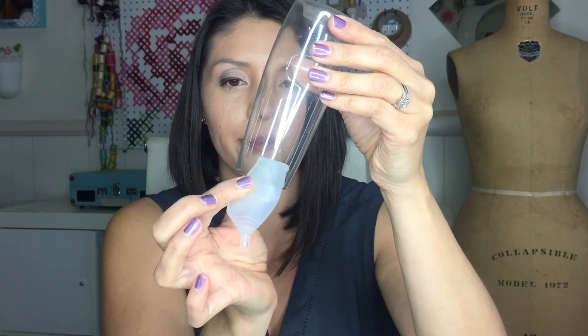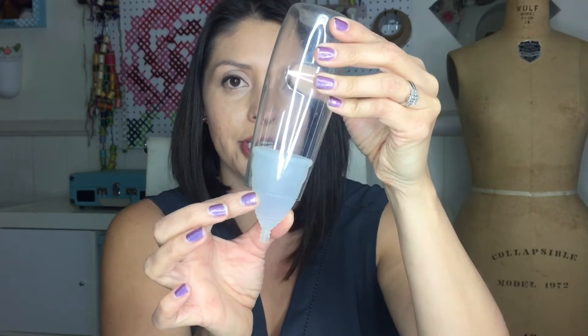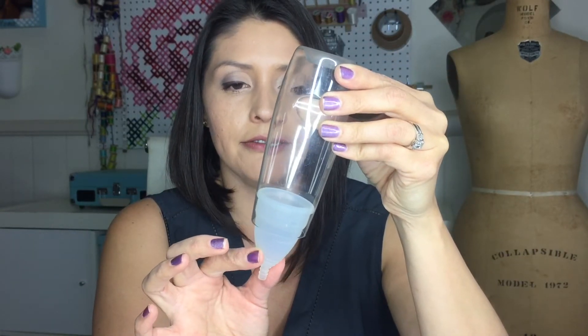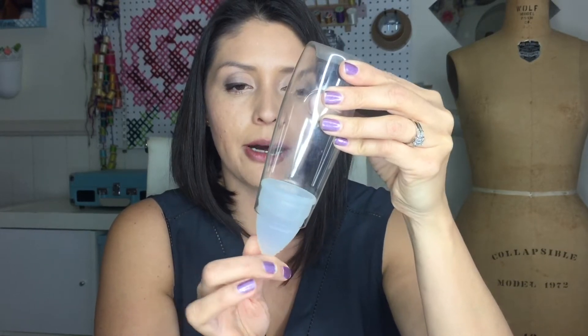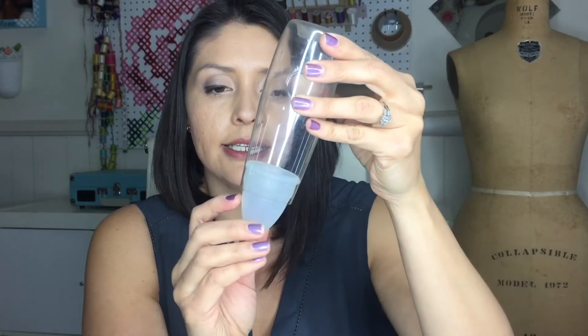When you insert it, you almost have to do a deep sumo squat. What I would recommend is doing a wide squat and bearing down. If you don't know what bear down means — like you're going poop, just push. When you're pushing, you're going to insert your cup at an angle, and even when you release the cup you're still pushing. Once it's in there and you feel it's okay, you can stop bearing down and then you can pull down or adjust or push up to make sure it's securely up there.